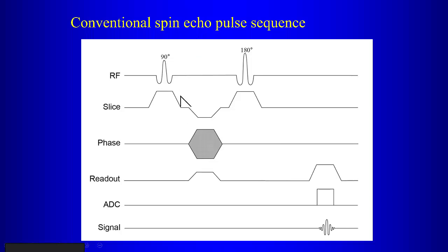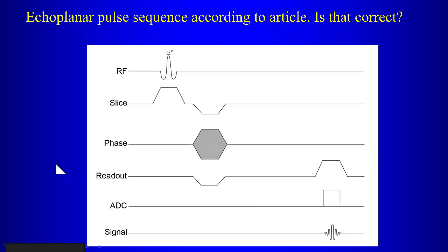So in essence, even spin echo sequences are gradient echo sequences. But they will use both the 180-degree pulse and the read gradient to focus the signal at the particular TE that you've selected. But the gradient echo sequence does it without the 180-degree pulse.